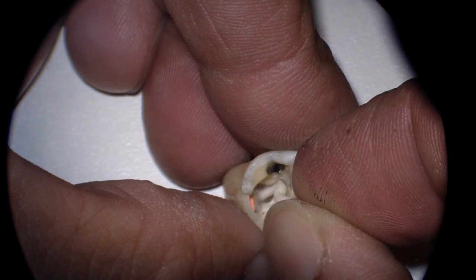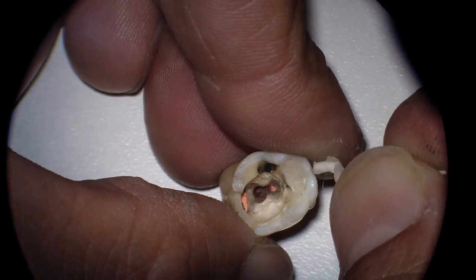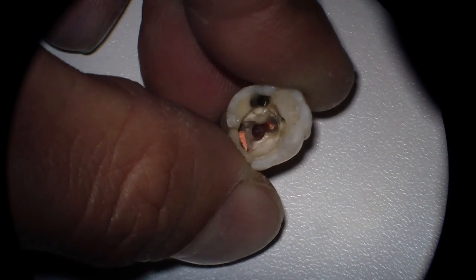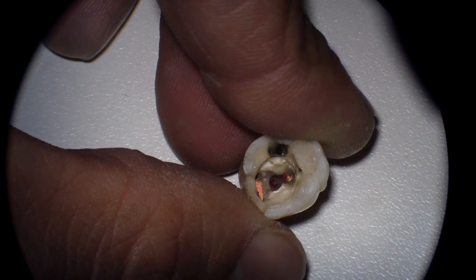You may have to place a cotton pellet in here with pressure. It may continue hemorrhaging for a few minutes, and it's critical to get it stopped — it'll make your life much easier.